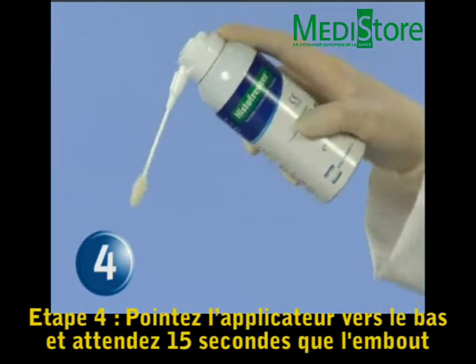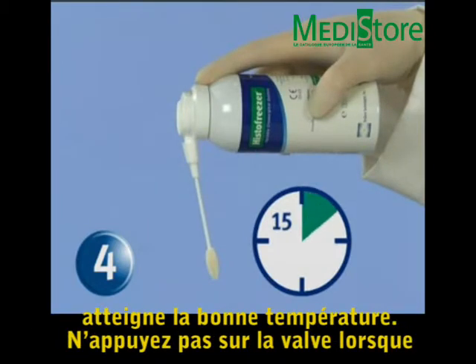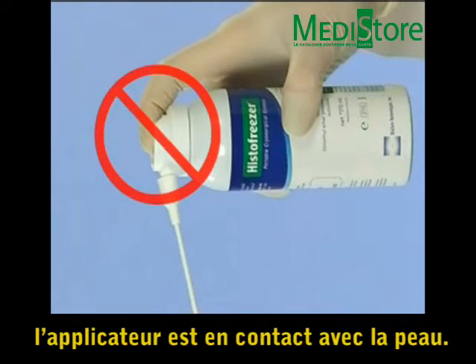Step 4: Point the applicator downward and wait 15 seconds for it to reach its effective working temperature. Do not press the valve while the applicator is in contact with the patient's skin.